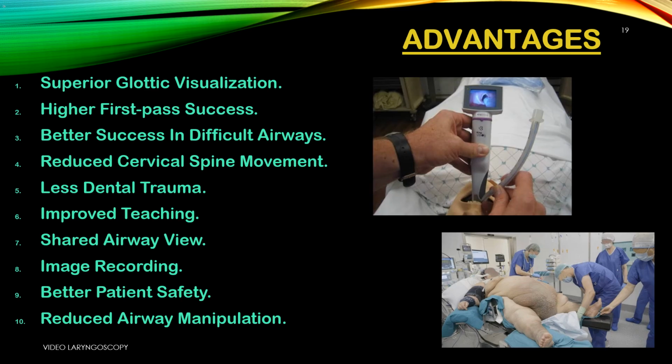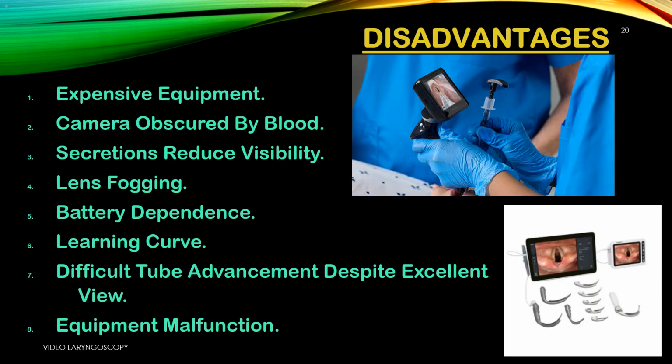10. Reduced airway manipulation. Less pushing, pulling, and force inside the mouth and throat. Less tissue trauma overall. Disadvantages. 1. Expensive equipment. Video laryngoscopes and disposable blades cost a lot. Not every hospital or department can afford them.